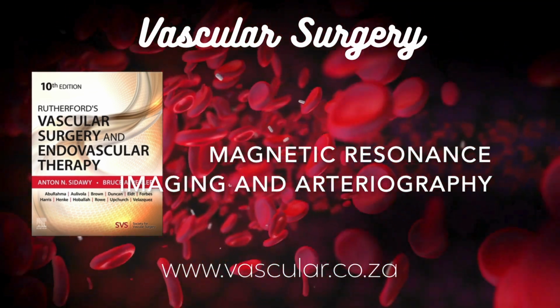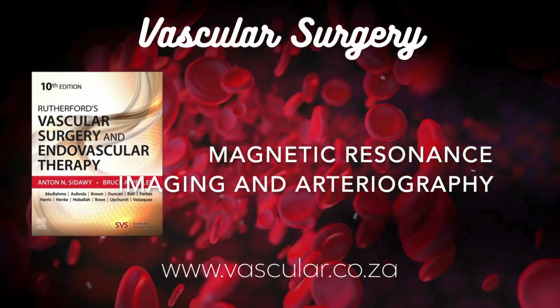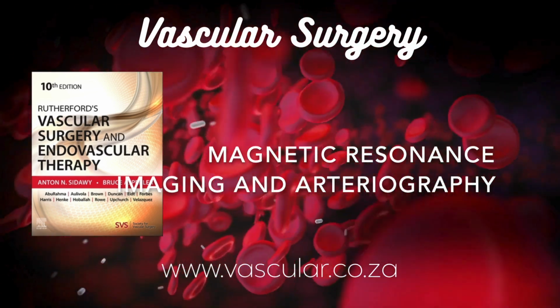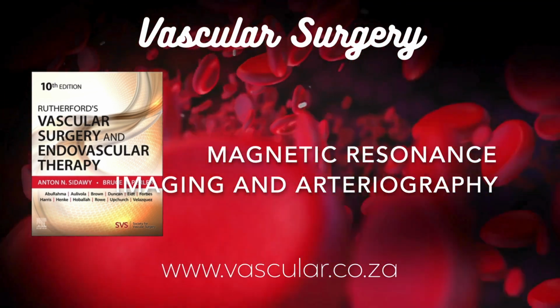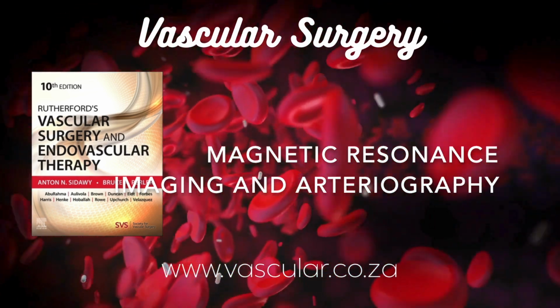Well, it's non-invasive, obviously. Plus, MRA can sometimes visualize the smaller runoff vessels down in the calf and foot even better than DSA, which is crucial for planning bypass surgery. And it's generally seen as more cost-effective. And those step table techniques help with the feet. Yes, things like step table or continuous table MRA have really improved visualization of those distal vessels.